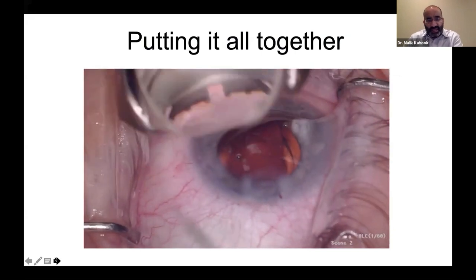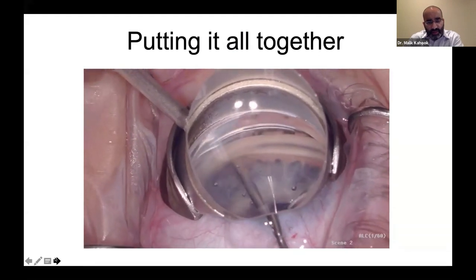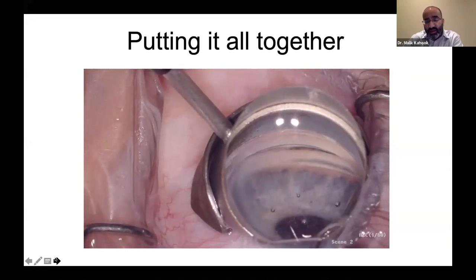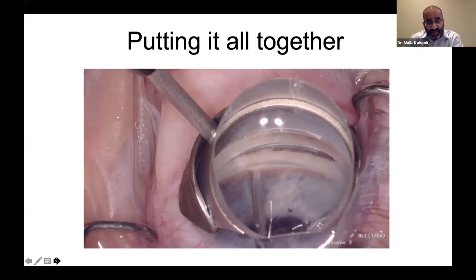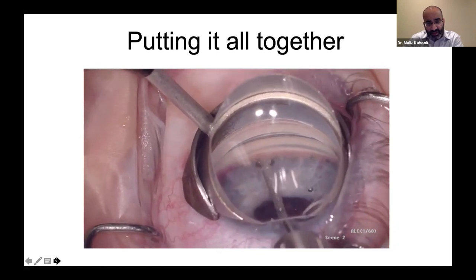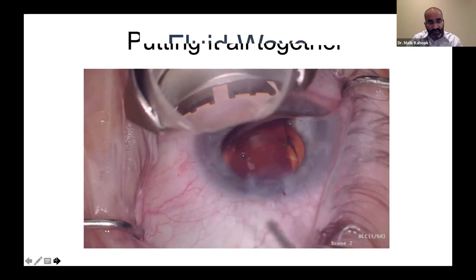Here is a video showing a patient who just had cataract surgery, then head tilted and microscope tilted for goniotomy. The view is great — the surgeon could zoom in a bit more to see more trabecular meshwork detail, but there is not a lot of movement or corneal striae, so the surgeon is not using the goniolens to direct the eye. The lens is floating on viscoelastic. At the conclusion, just grab the strip of trabecular meshwork and the procedure is done — a smooth, combined case.